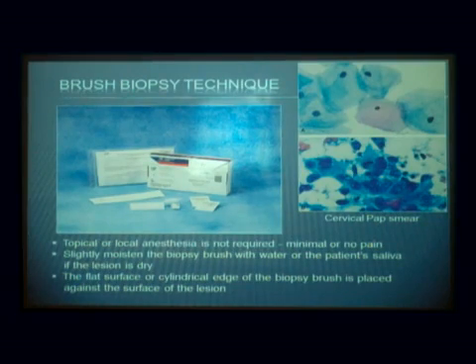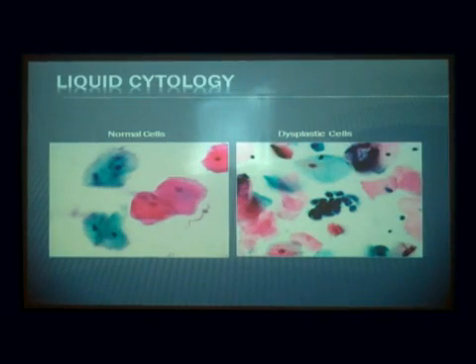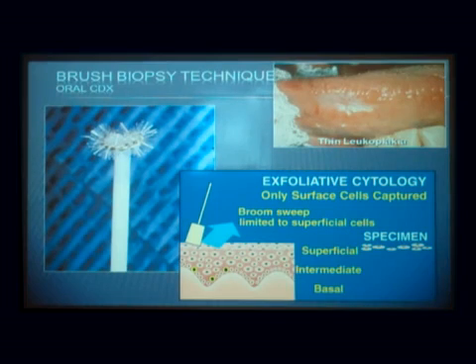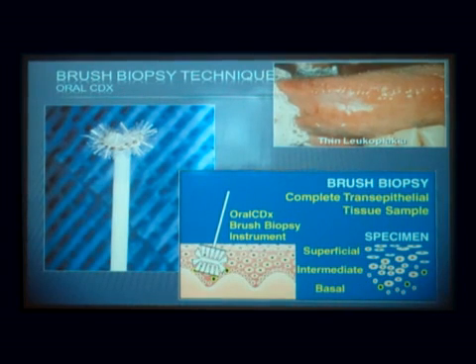But what did this group do? They called it a brush biopsy. It wasn't, I guess it was a brush. But instead of scraping, it really is, I don't know if any of you smoke a pipe or know pipe smokers, but it's just a pipe cleaner with a little twist on the end and a little piece of plastic to hold it. That's all it is. And yet the idea is to, instead of scraping along the top of a white patch, you just spin this right in, without anesthesia this is done. Spin it right into a white lesion until you see a little drop of blood, and then you know you're down to the bottom cells, the cells that are most likely, that's where the bad cells come from, remember?